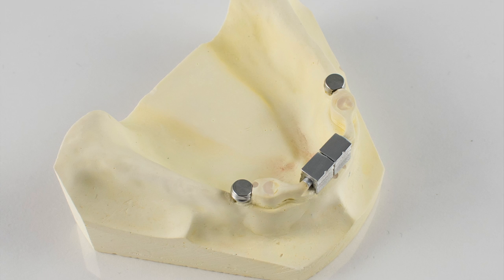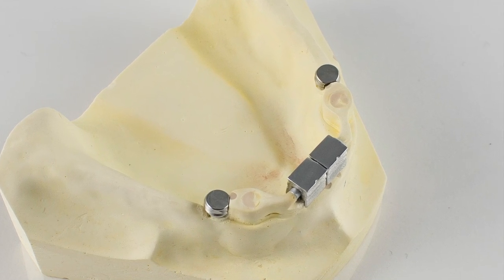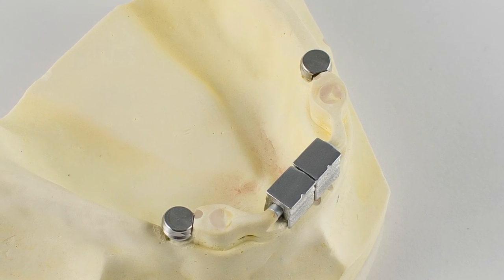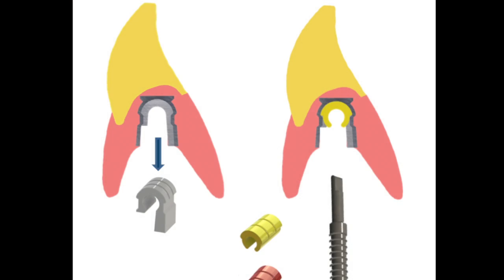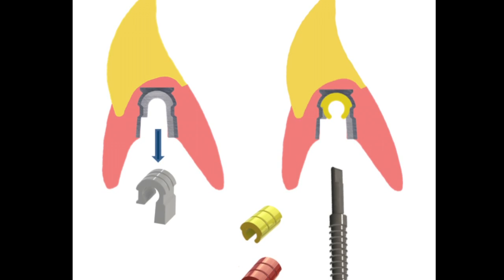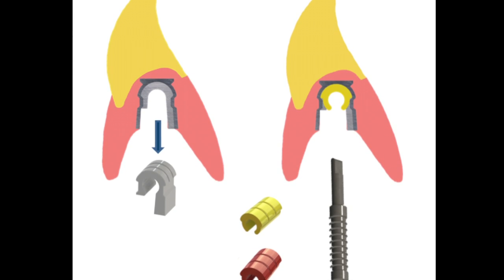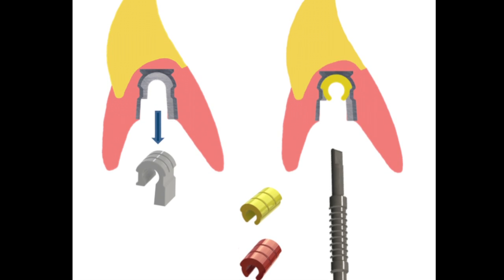You will also have to seat a micro ERA partial denture metal jacket onto each ERA jig. You can now process the denture using whatever technique you prefer. Remove the processing riders from the metal housings. Use the LV Universal Insertion tool to seat the final riders into the metal housings. This is the only tool which fits both the 5mm and the 3mm length clips.